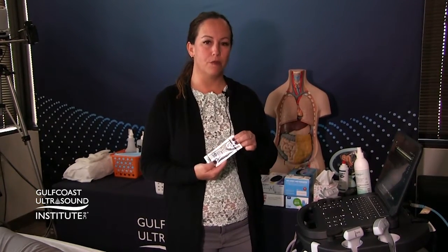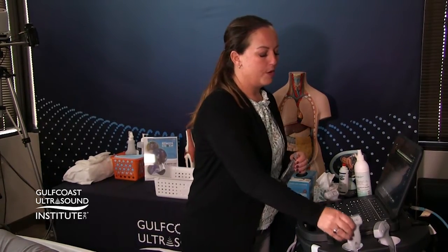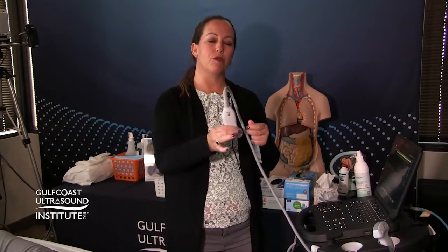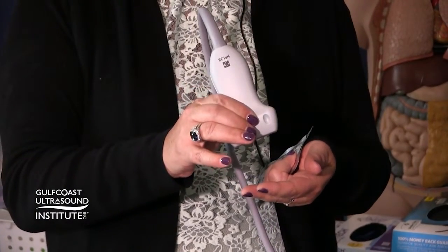When you have a patient with an eye injury, you don't want to transmit a lot of pressure from the probe to the eye. Use a lot of gel — preferably a sterile lube or sterile gel packet. Hold the probe in your hand and use the fourth and fifth fingers to rest on the patient's orbital rim or nose, putting most of the pressure there. Press very gently on the eye itself.